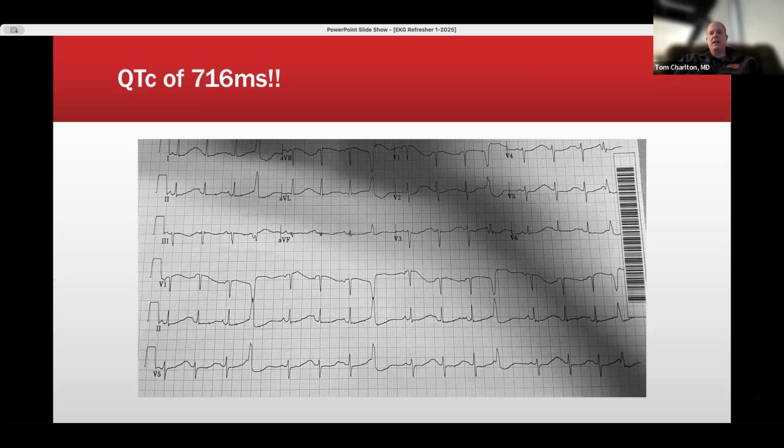The EKG in this case saved this woman's life because now we know what's wrong. Now we know how to treat it, and we can begin fixing things. So I want to show you where her P wave is. If you look here, this right here, this is all her T wave. And look at that little bump right there. That's her P wave.